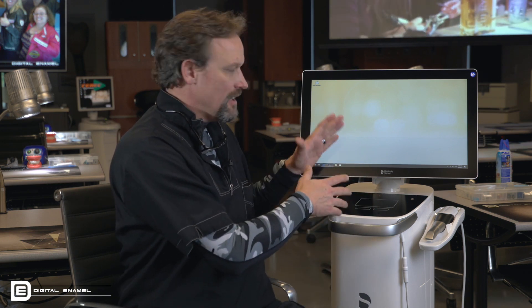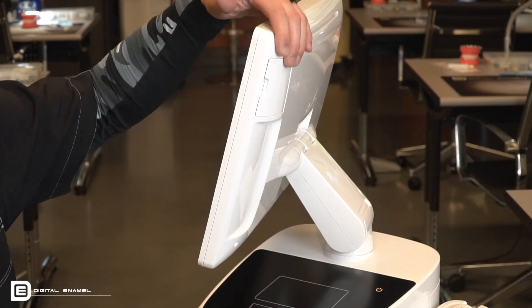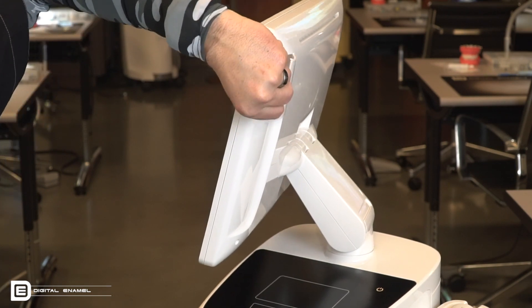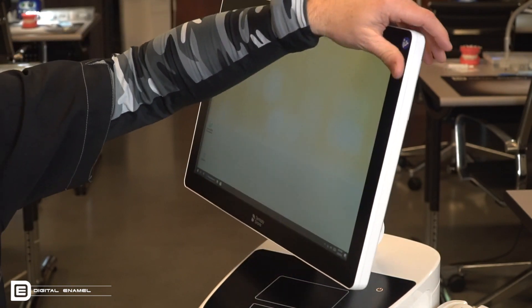You'll eventually discover one that you like. It also has two USB ports right here — so if you wanted to connect a mouse or a keyboard, you certainly can.